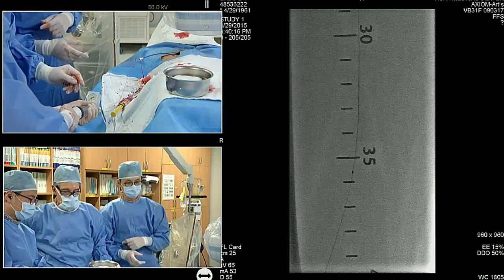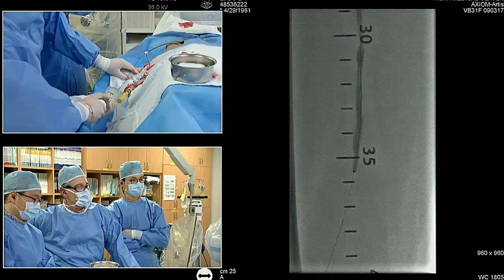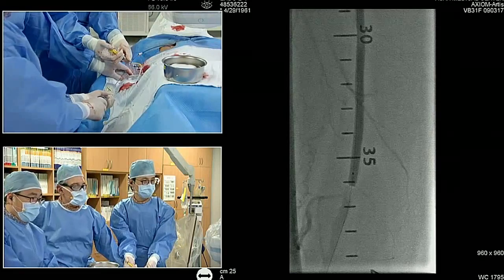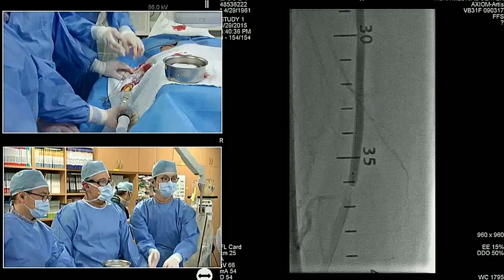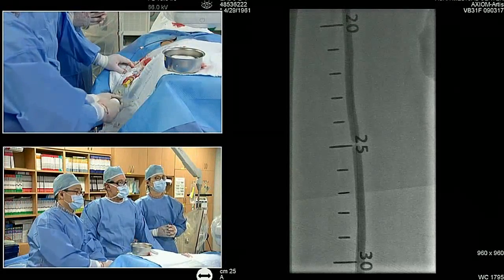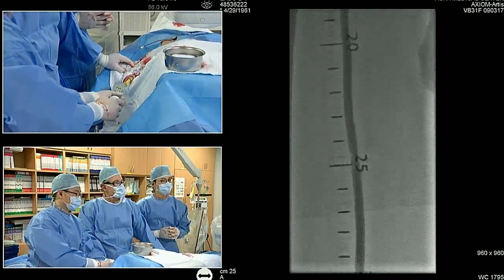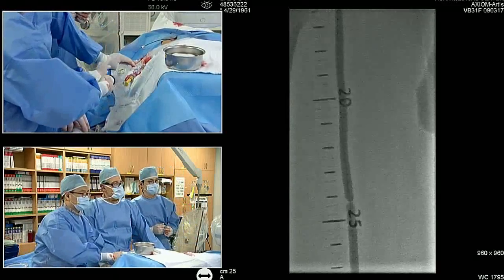Okay. Go on. So again, this is a 5.0 by 220. Take it up gradually. Tell the patient you may feel a little discomfort. Okay, monitor that. Yeah, the patient's feeling that one a little bit. I think that's a fold in the balloon rather than a lesion. A twist, yes. I think so. So why don't you deflate, and then we can reinflate.